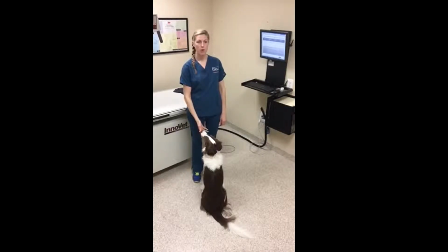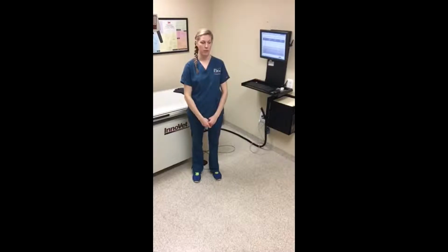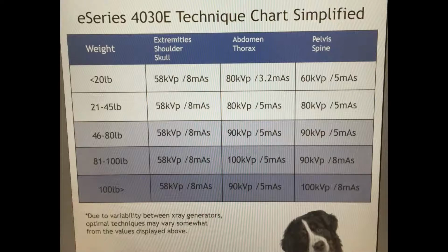It is an essential component for obtaining diagnostic quality images in a consistent way, as well as limiting waste and increasing safety by reducing repeated exposures. At my practice, we are currently using the generic technique chart that was supplied with the purchase of our X-ray unit.